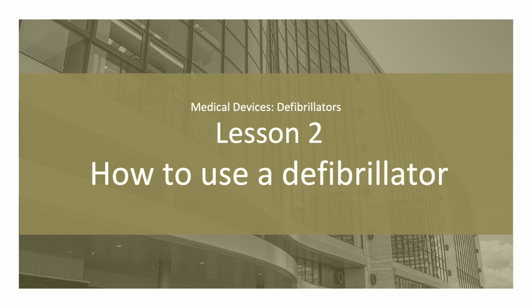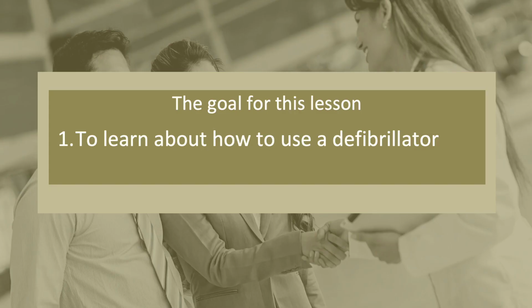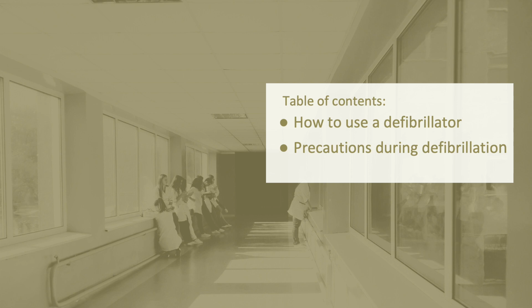Medical Devices, Defibrillator, Lesson 2, How to use a defibrillator. This unit covers the basics of medical devices. The goal for this lesson is to learn about how to use a defibrillator. This is the content of this lesson.